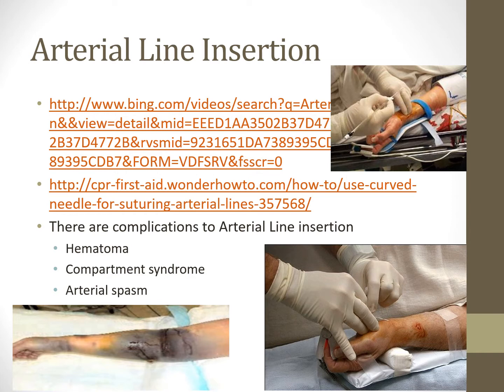So the more we can get that radial artery to come to the surface with positioning, sort of like the head tilt chin lift and/or the jaw thrust, right? You're positioning or aligning the TPO for intubation. You're allowing that positioning to optimize the insertion of the ET tube. Well, same thing here. You're allowing this positioning to optimize floating that catheter, and that's going to be the hard part. It's not necessarily getting the flash and getting the blood, it's floating that catheter with the A-line insertion.